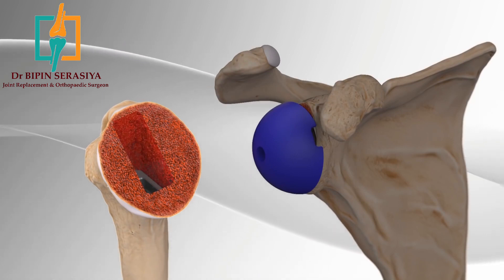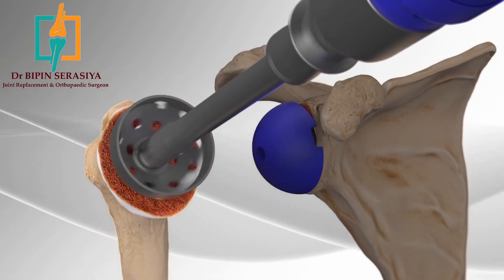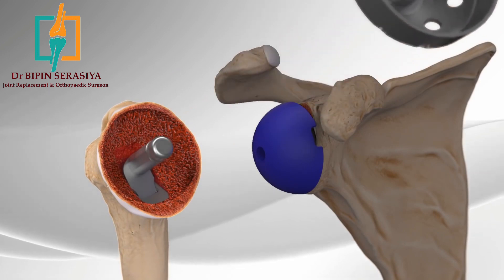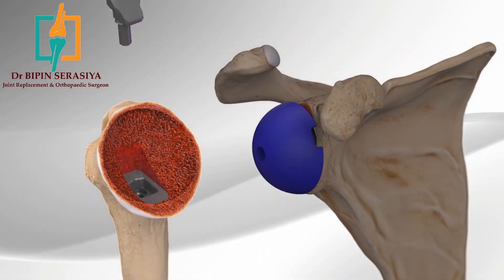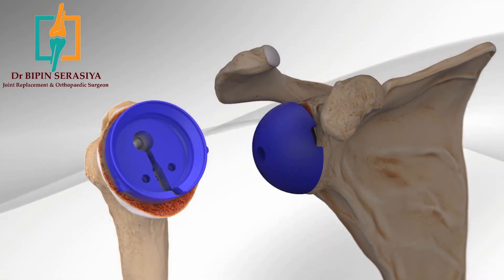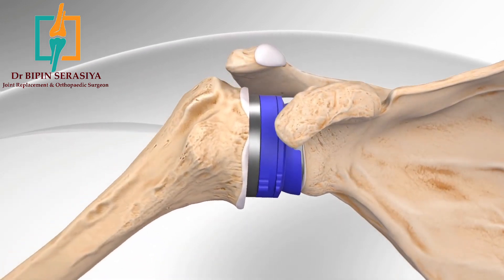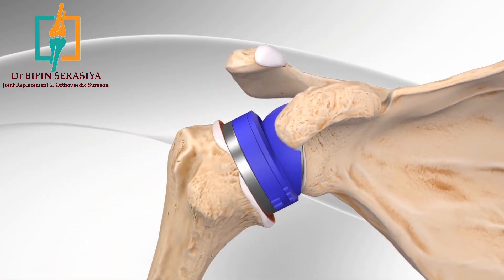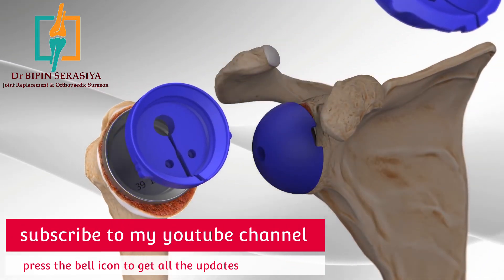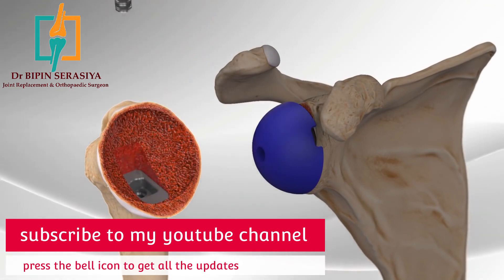Once the size has been determined, part of the bone is removed and smoothed out in order to place a trial implant. After the trial implant is in place, the surgeon places the socket onto the ball and assesses the stability of the joint with the implants chosen. After appropriate sizing, tension, and stability are determined, the surgeon will then remove the trial implants on both sides of the joint.